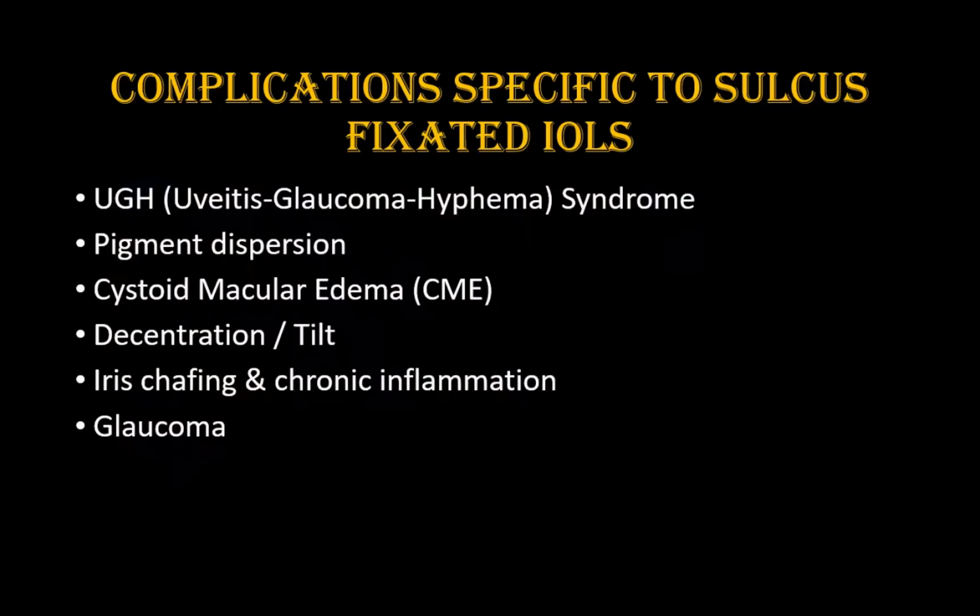So complications specific to sulcus supported IOL are UGH syndrome, pigment dispersion, cystoid macular edema, decentration or tilt, iris chafing or chronic inflammation, and glaucoma can happen if it is not properly managed or properly placed.